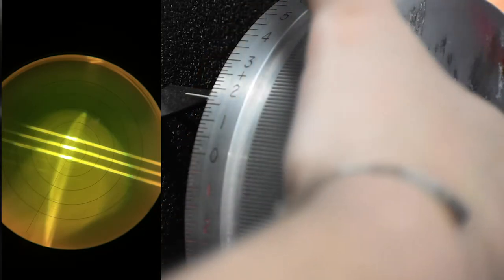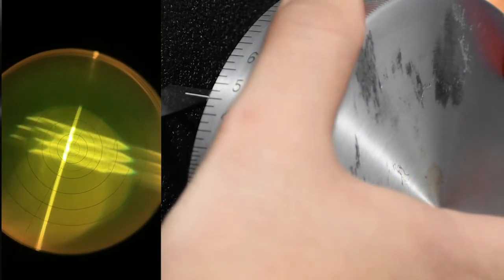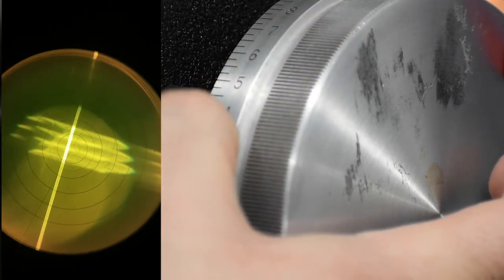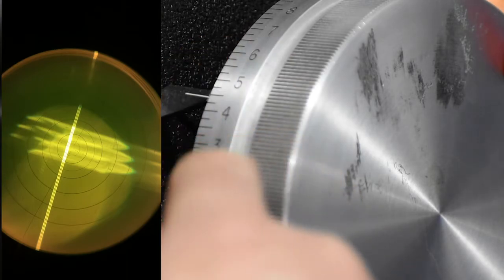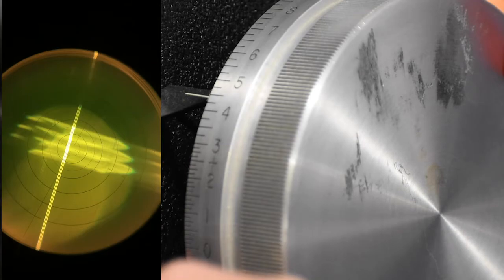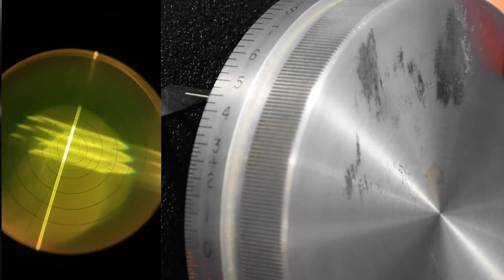So we talked about how add is you're adding a prescription. So obviously we're gonna go in the plus direction, moving the drum towards us, okay? So as we move the drum towards us, we'll notice that the three little thin lines get sharper and sharper and sharper until about right around there. So it looks like we're at a 450. So again, the difference from where we started to where we stopped, that's going to be your add power, so this one will be a 275 since we started at a 175. It'll be a 275 add.